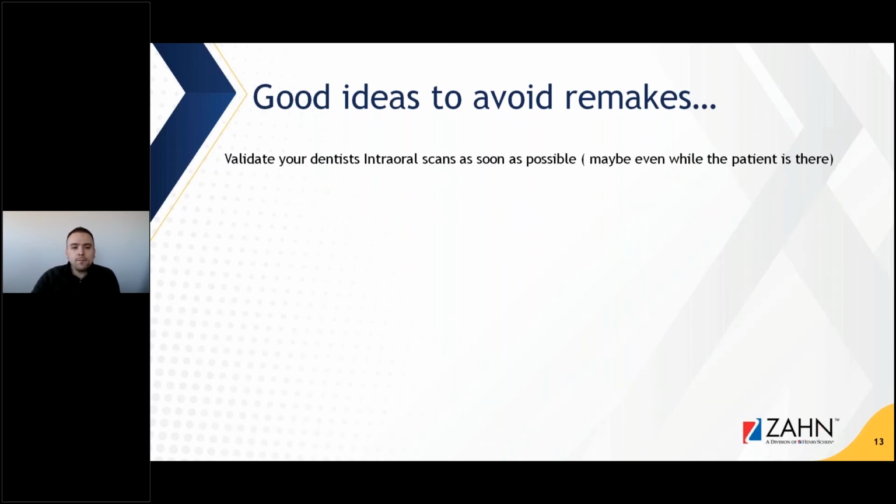So validating your dentist's intraoral scans as soon as possible, and then maybe even while the patient is there. So this is, once we mentioned that Henry Schein's design services, how they have a scan validation tool that actually allows for you as a lab and as a dentist to validate the quality of those scans while the patient is there. During COVID times now, rescheduling has become a big problem.